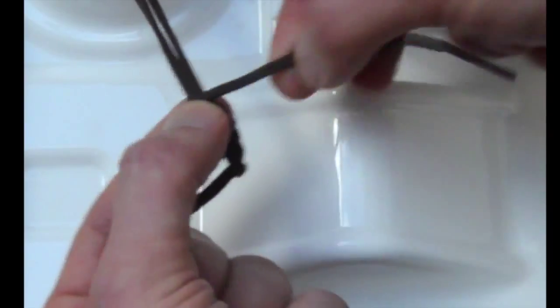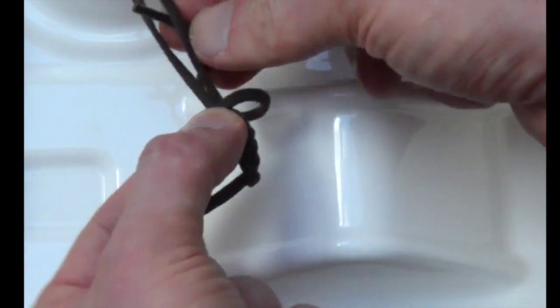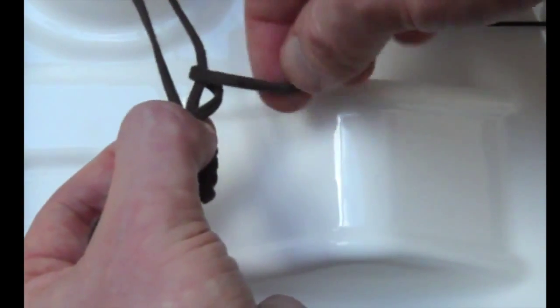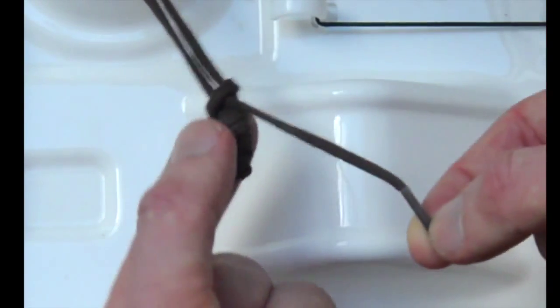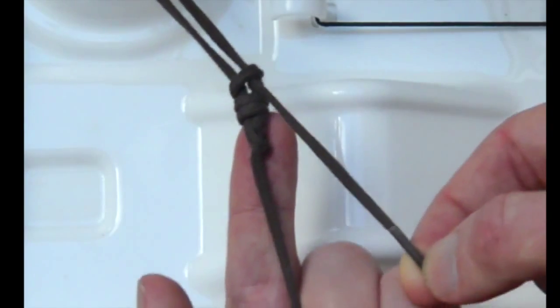Before throwing a final hitch. And that's the Roeder knot.